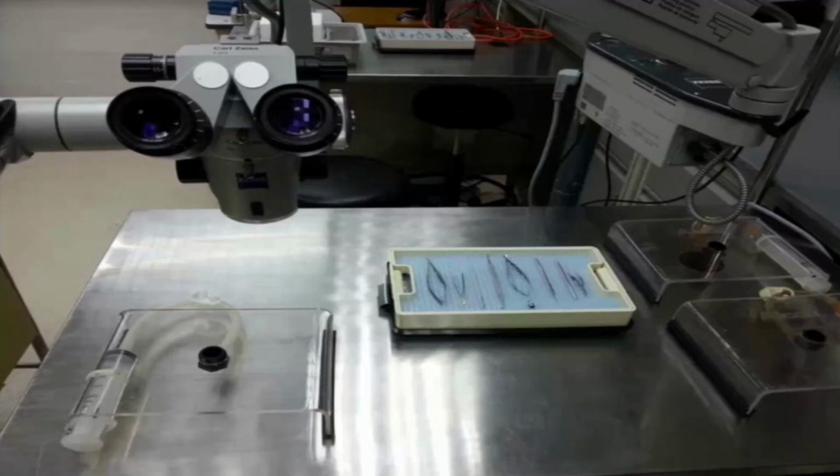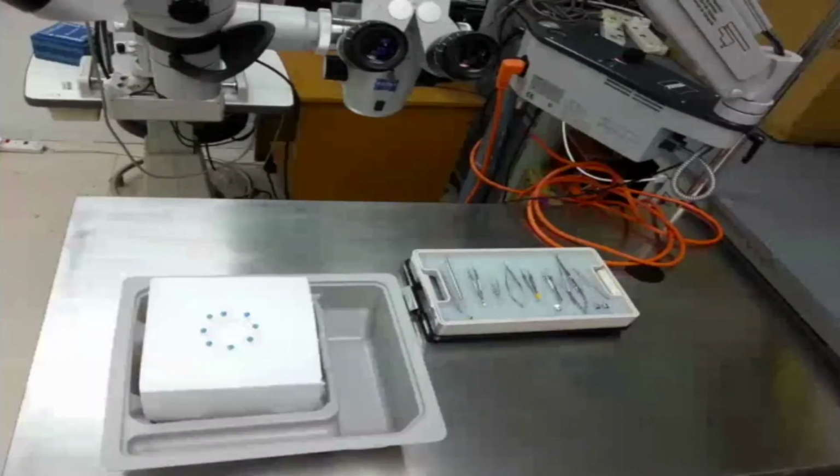The other thing is, in case you cannot find this or it is not functioning, you can just do a simple thing: pin the eyeball on the surface, so that you have a firm eye for you to operate on.